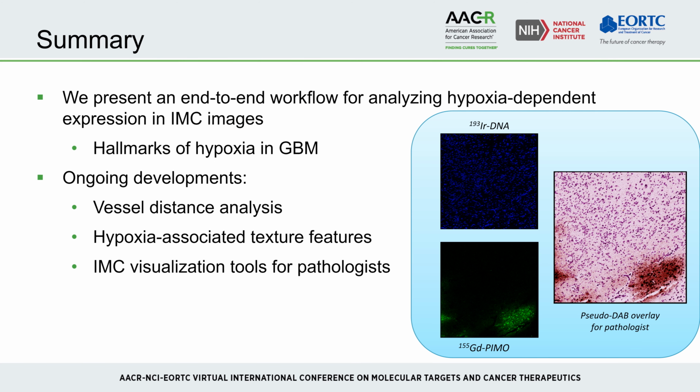So in short, we present an end-to-end workflow for analyzing hypoxia-dependent expression in IMC images. Some of the ongoing developments include vessel distance analysis, evaluation of hypoxia-associated texture features, and IMC visualization tools for pathologists as shown on the right.